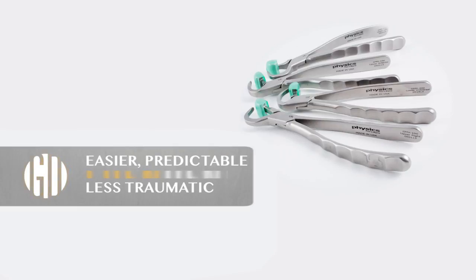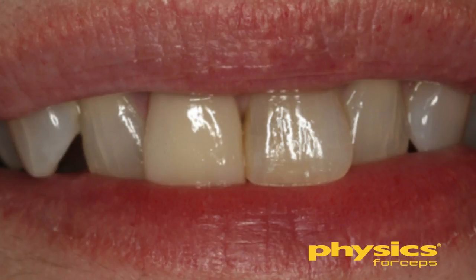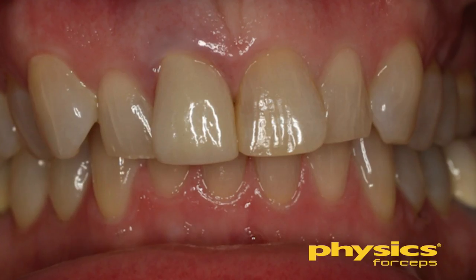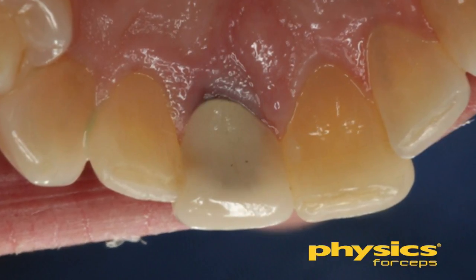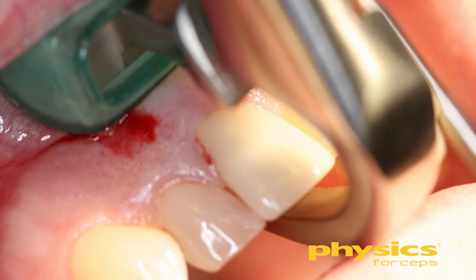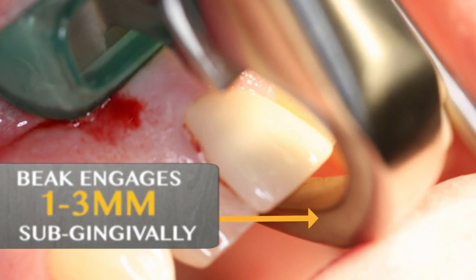We're going to remove an upper anterior tooth that was deemed non-restorable by our endodontist. The patient has some symptoms and we see some tissue changes occurring on the facial aspect of the tooth. It had a crown and we've determined this tooth needs to come out. We will take our physics forcep — remember it has two parts — the beak is the working part and we're going to engage the palatal or lingual surface of the root.